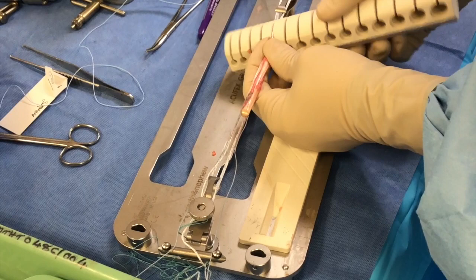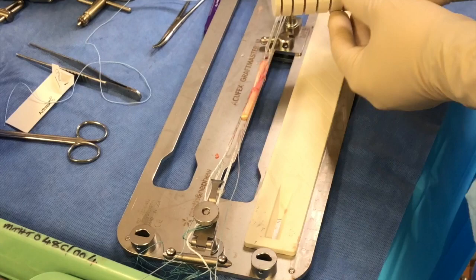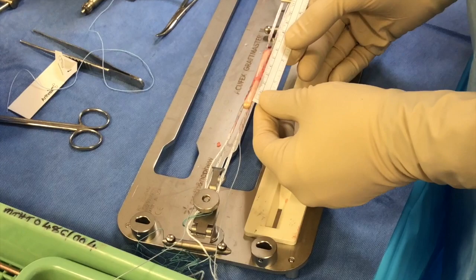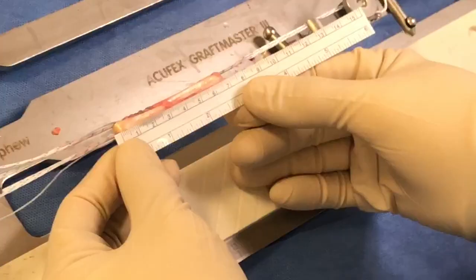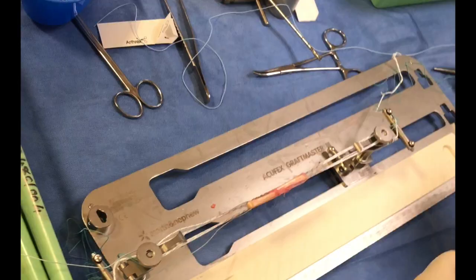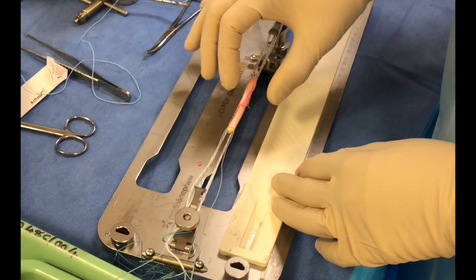Then we try again to see the femoral end — the femoral end will fit through a 6.5. So I'll be able to tell the surgeon that the femoral end will be 6.5 and the tibial end will be 7. You can also check the length of the graft we have now — in this case it's 6.8 centimeters.